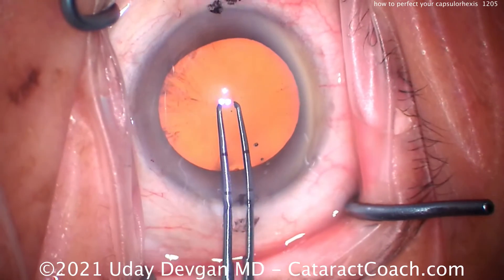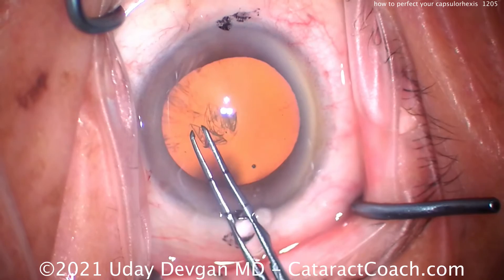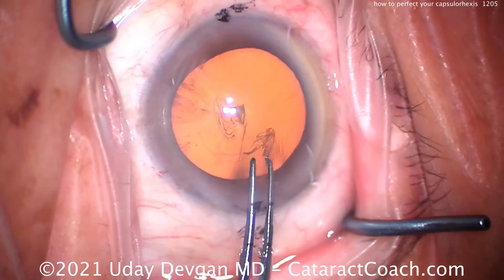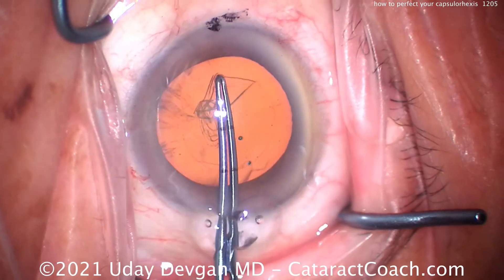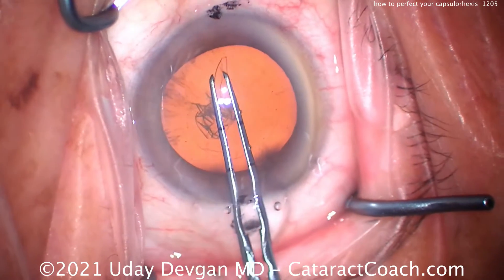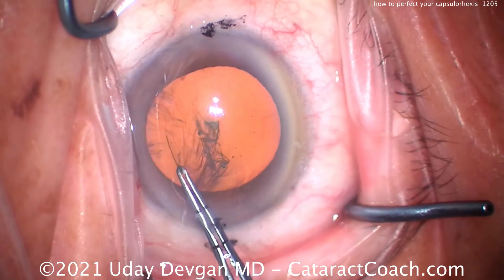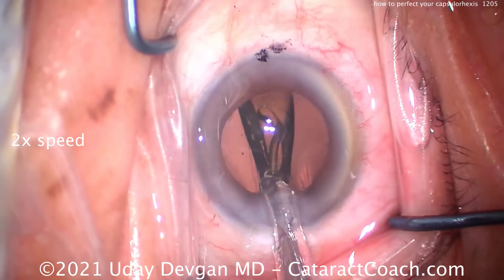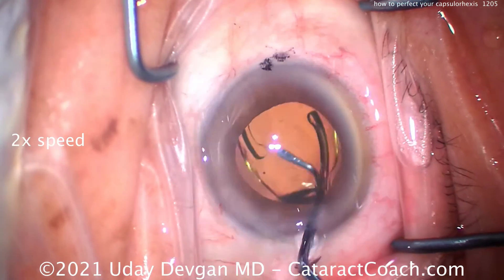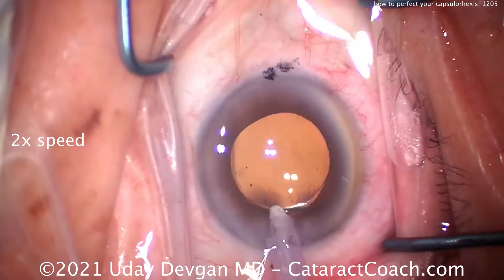We've got the EDOF lens standing up beautifully. Here's another case — going with the four steps, going to start right in the center there, poking in, getting our rexis started and bringing it around. We'll grab it again and I'm spiraling it out to the size that I want, and once I have that size I'm going to keep that size. Notice how we pivot in the incision — grabbing it here and pivot, pivot, pivot — keeping it that exact size. The key at the very end: don't pull centrally. Finish by continuing that curve, and that's how it's going to be perfectly round. Here at the end we'll deliver the lens and in comparison to that 6mm optic, you'll see this is a capsulorrhexis that's beautifully round and overlaps just right.